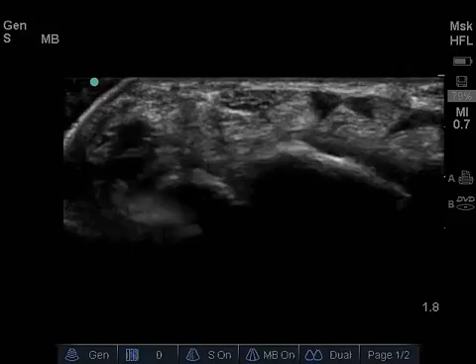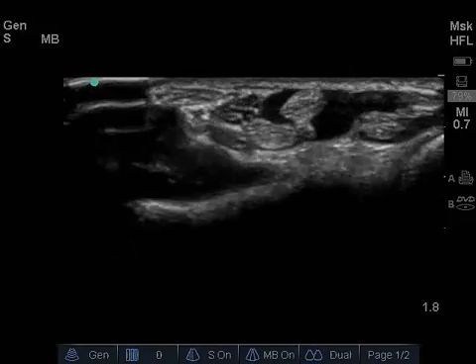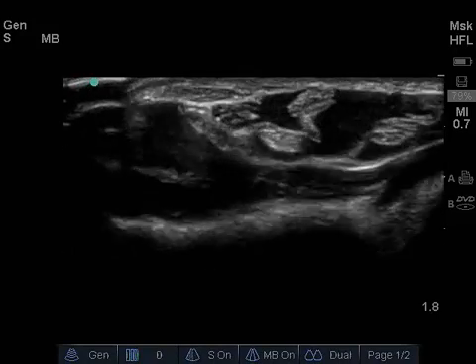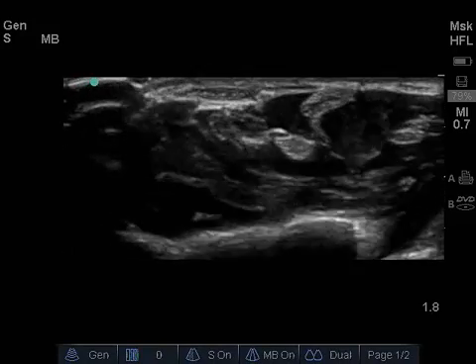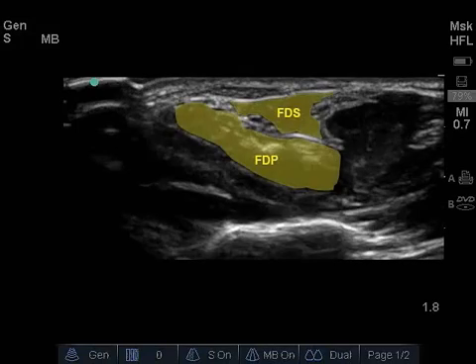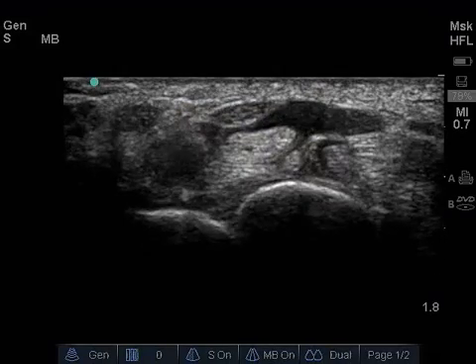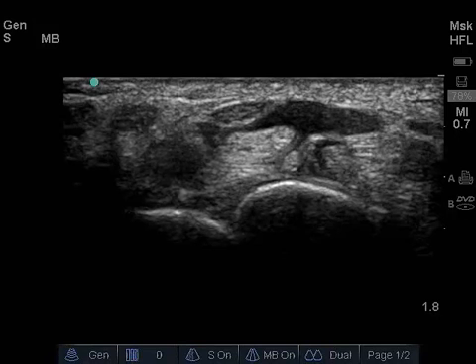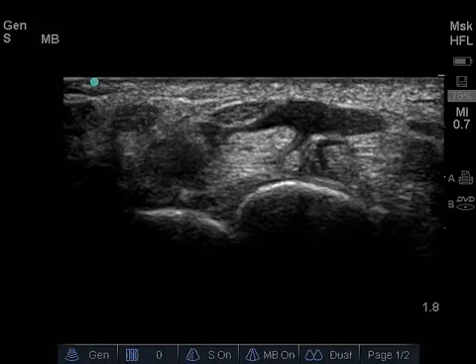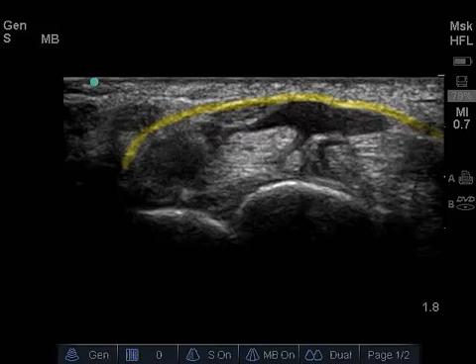In addition, by moving the transducer proximally, the median nerve will move between the flexor digitorum superficialis and profundus muscles. At the level of the carpal tunnel, the transverse carpal ligament, or flexor retinaculum, appears as a thin hyperechoic band superficial to the median nerve.